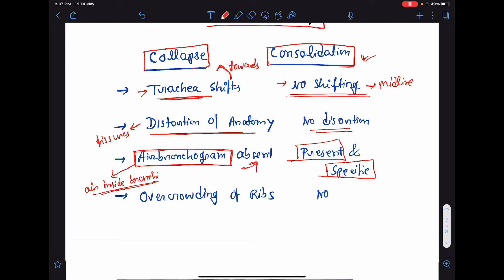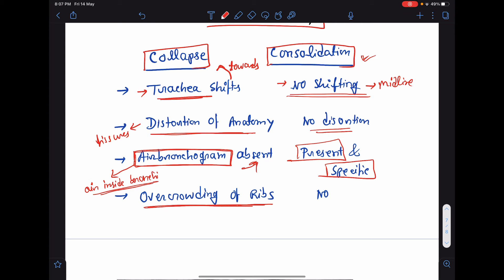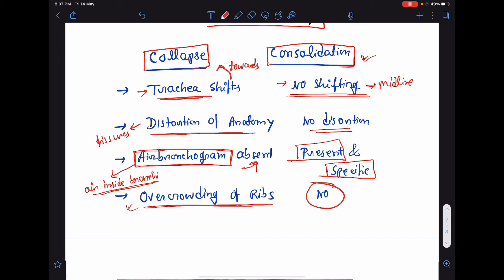In collapse, there will be overcrowding of ribs. As I have already mentioned, the lung architecture will be distorted and there will be overcrowding of ribs. But in case of consolidation, there is no overcrowding of ribs. So, these are the few points by which we can differentiate between consolidation and collapse.